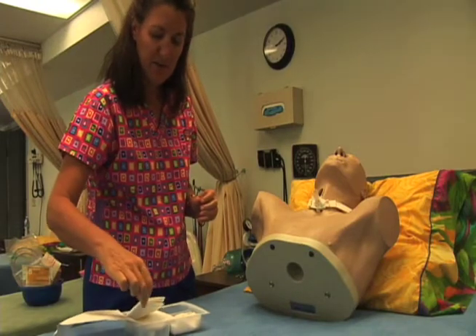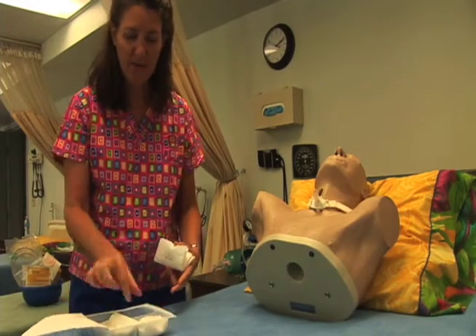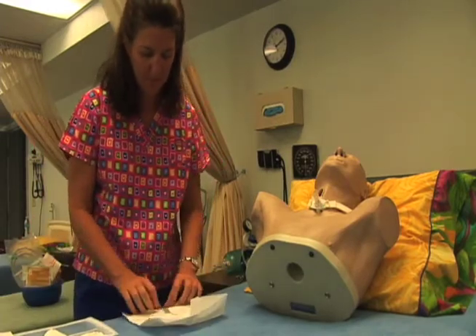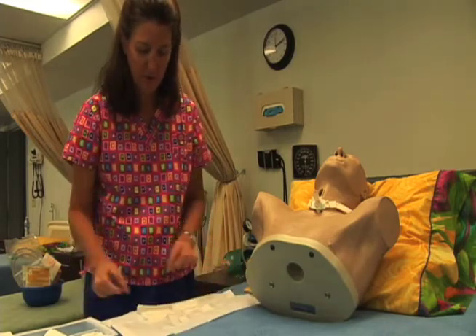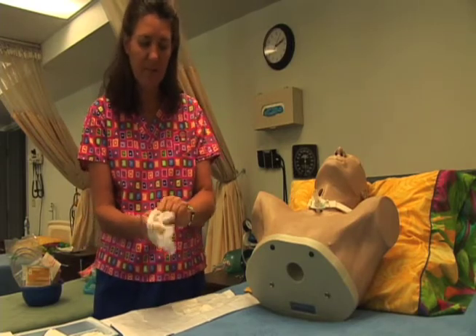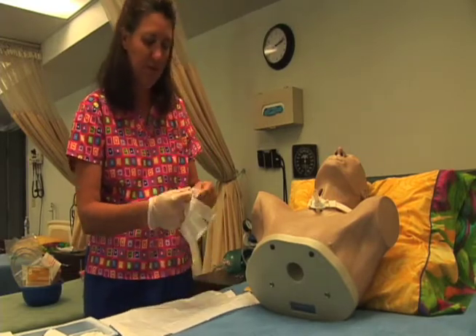Now be really careful to get your gloves out with sterile technique. You can move this around from the outside, but don't touch it from the inside because it's sterile in here. Now these gloves go on sterile, and when you're working with a real patient, you are not going to be using your bed as your surface. You're going to be using your bedside table. Remember, under the cuff for sterile technique for your gloves.